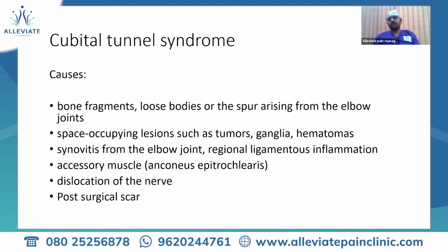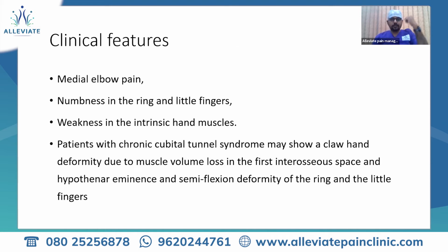One important thing before evaluating with ultrasound is that you have to keep the elbow extended, not in a flexed position. Okay, because in the flexed position the nerve can get dislocated. So you have to keep it extended and then evaluate the nerve.